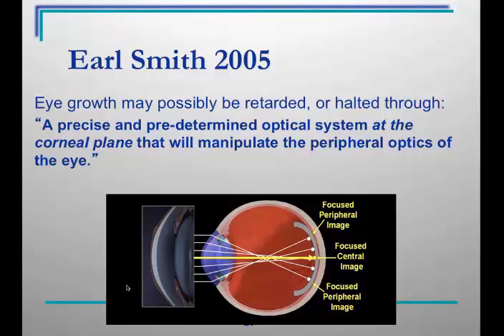Well, the other option for this young patient is, in fact, corneal reshaping. And that's a very exciting topic today, beginning with the research. And we always wanted to know why corneal reshaping tends to result in myopia control by as much as 50 to 60% of slowing down axial length growth.